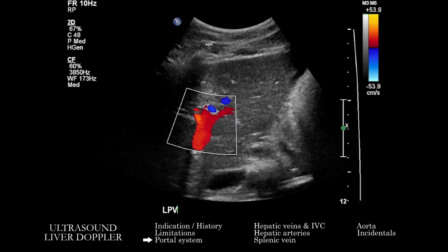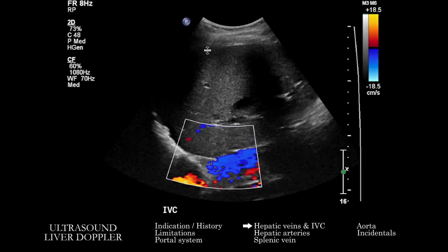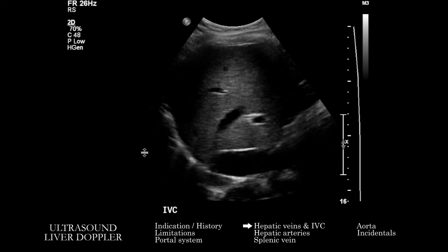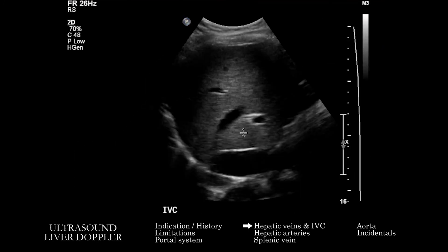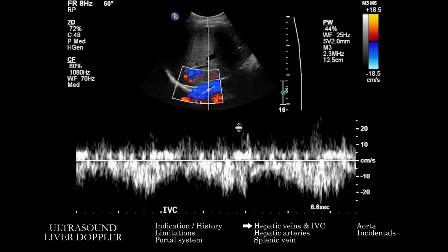Now we go on to the IVC and hepatic veins, asking similar questions. First on grayscale: are the vessels patent? Is there material in them? Are they normal in caliber? Is there internal echogenic material? Are we seeing collaterals on grayscale or color? There may be rare variants in IVC anatomy, which we can sort out on prior imaging and correlate with the current exam. On color Doppler, is there gross patency? Are we seeing collaterals? Is the flow in the expected direction? Make sure we correlate what color matches with flow direction towards or away from the ultrasound probe.